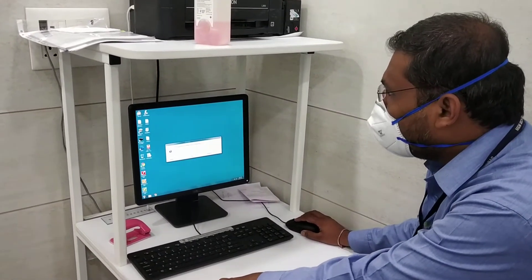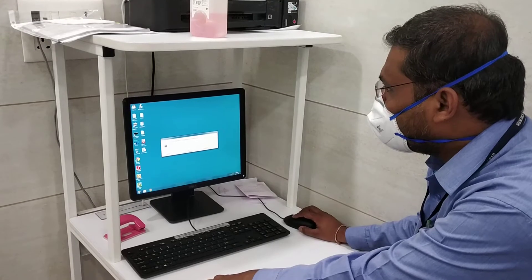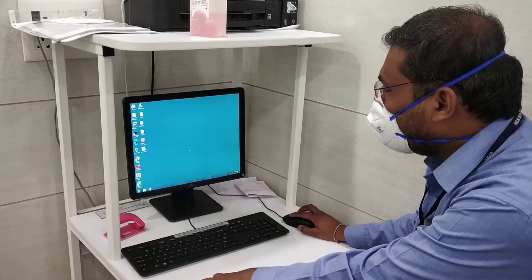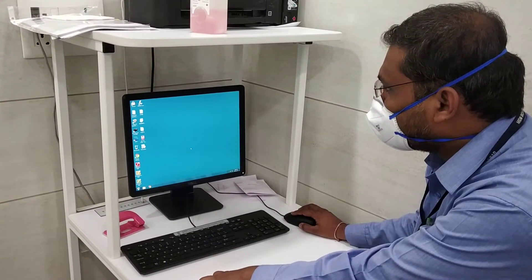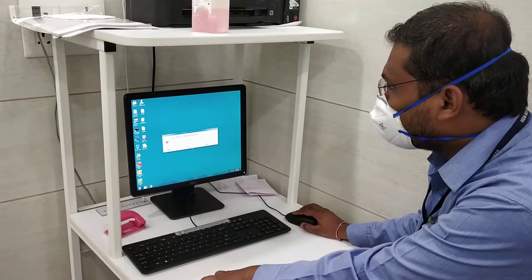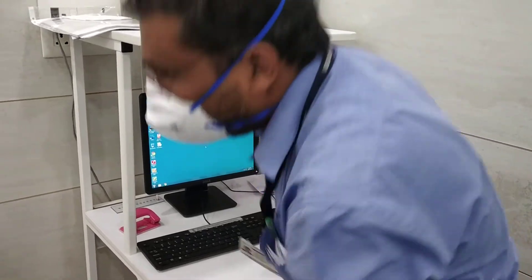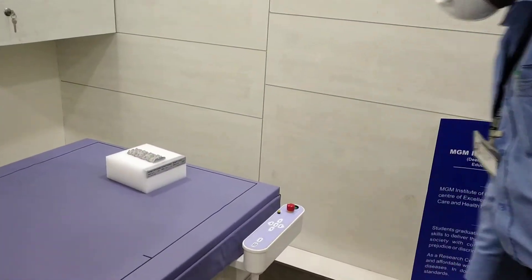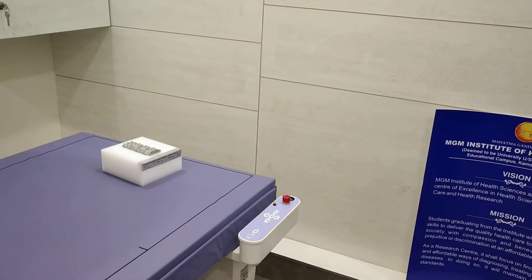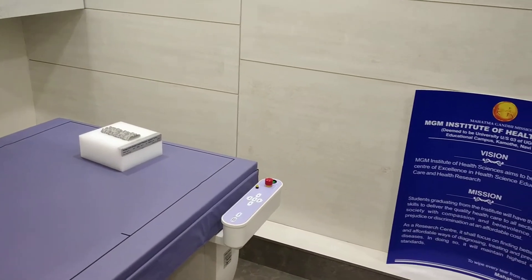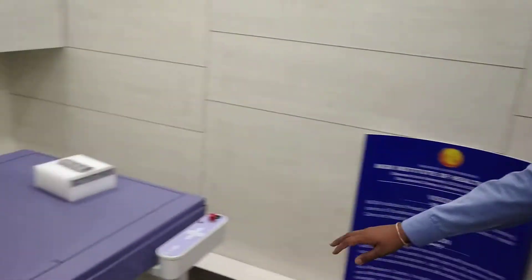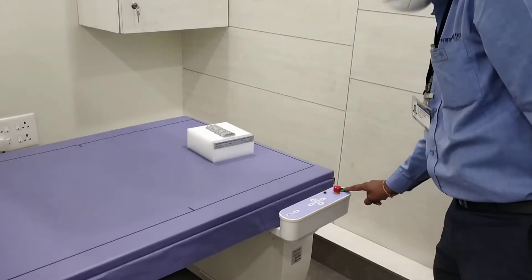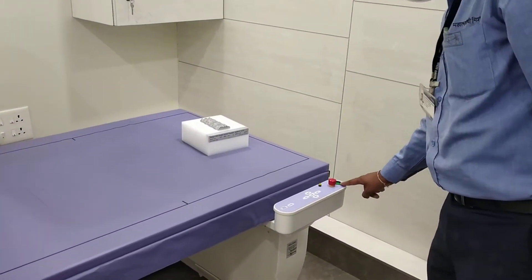You will see an error in function command — press OK. After that you have to switch on the machine from here. This is your central panel; this is your switch to turn on the machine.